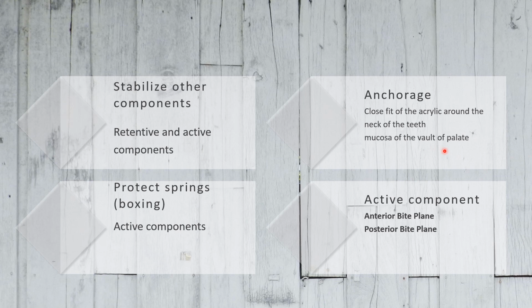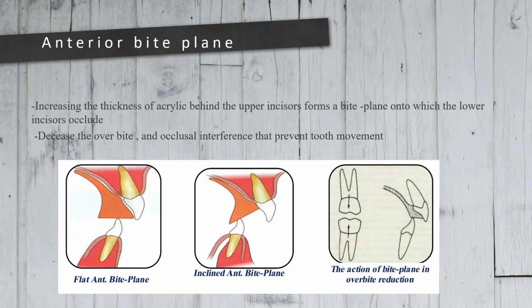The acrylic base plate also acts as an active component by adding modifications, and these modifications include the anterior bite plane and posterior bite plane.